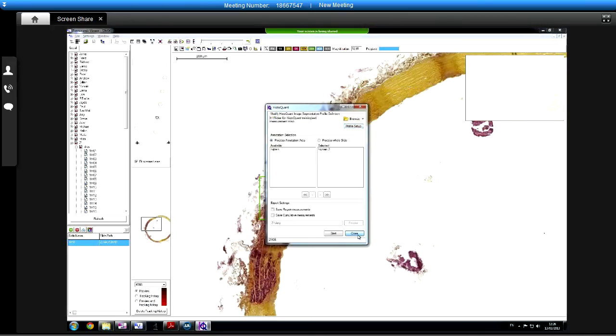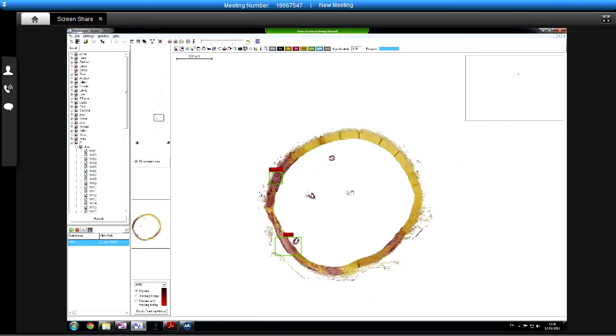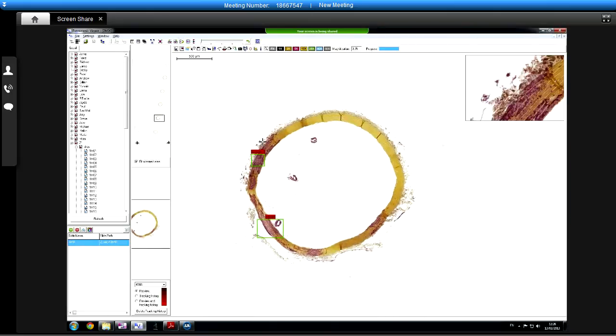So now, what about this stuff out here? Would you measure this or only within the actual? Yeah, probably. Like, if I was going to draw it by hand, you draw around so that you treat this as stuff that's fallen out.